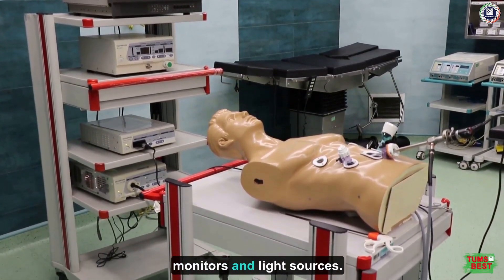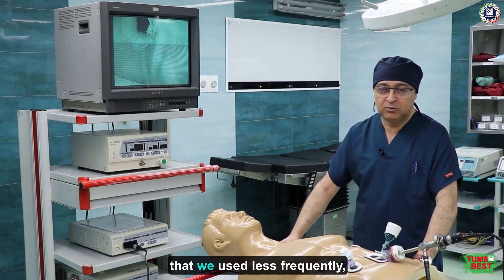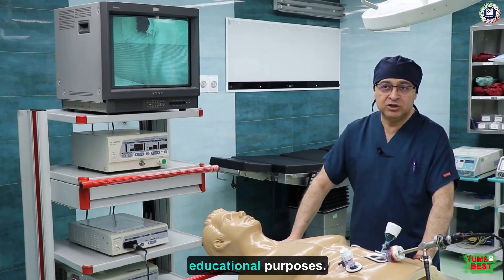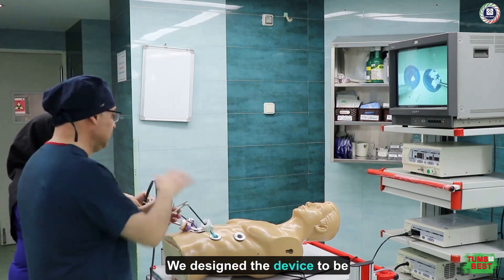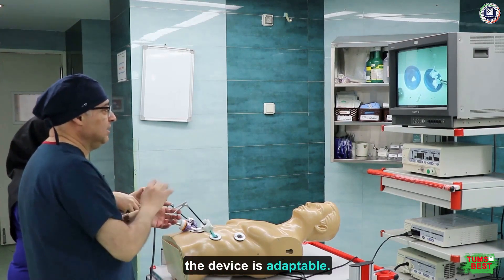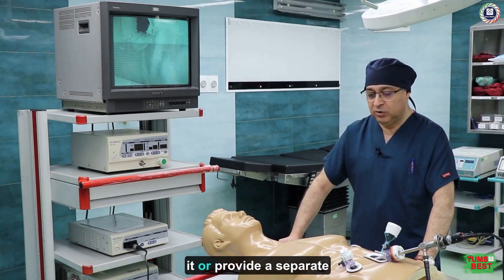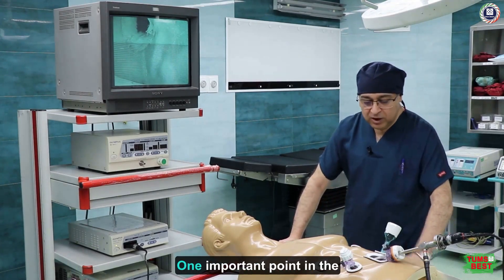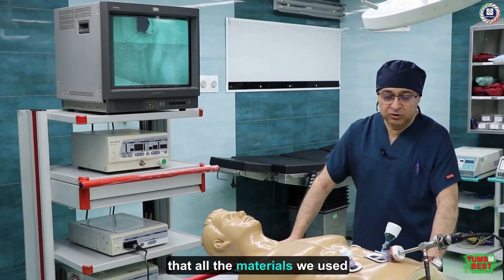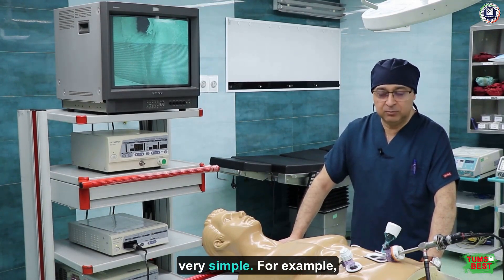We designed it to connect to our own equipment. Some devices have separate monitors and light sources, but since we had an older device that we used less frequently, we could utilize it for educational purposes. We designed the device to be compatible with this equipment. Of course, the device is adaptable — we can place a light source on it or provide a separate monitor. One important point is that all the materials we used are sourced from Iran.